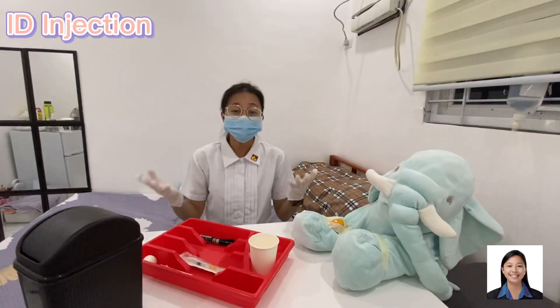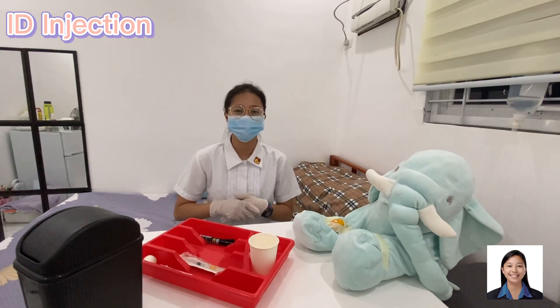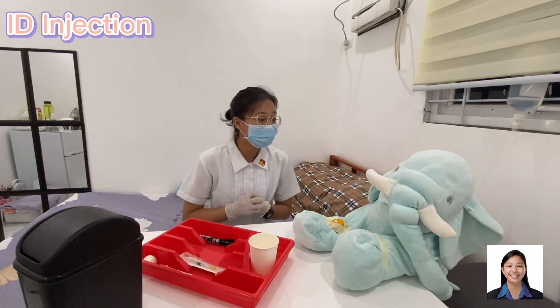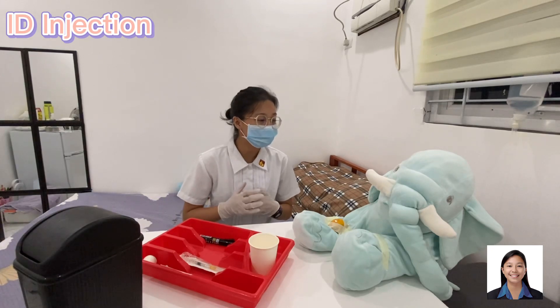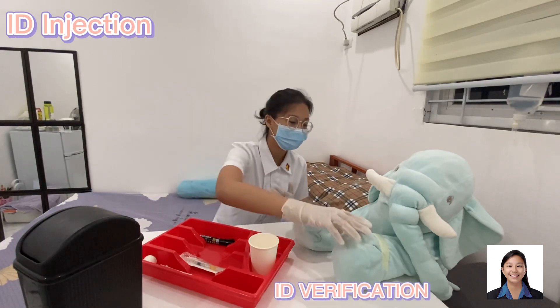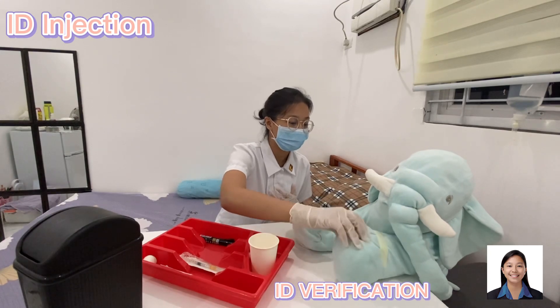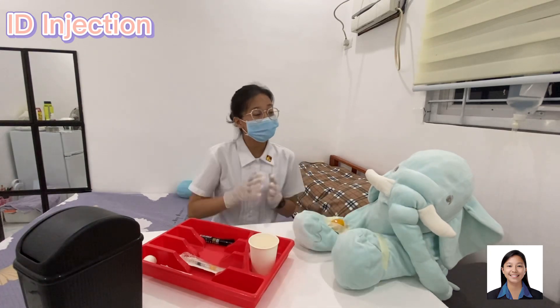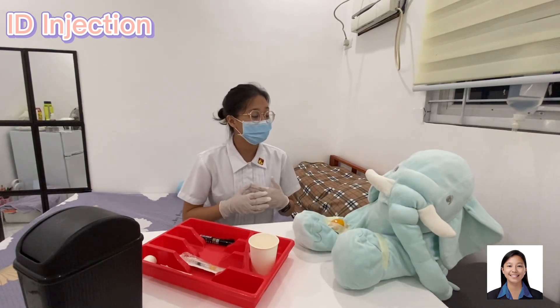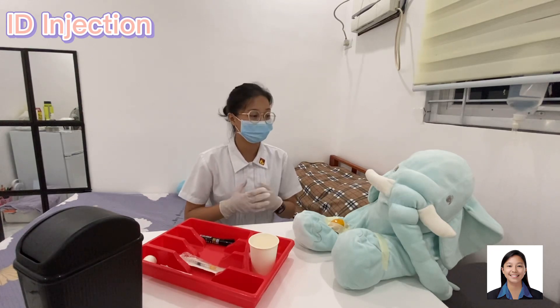First, we will do the intradermal injection skin test. Good evening, sir. I'm Shane Carlong, your nurse for today. May I check your wrist? I'm going to perform a skin test to make sure that you don't have an allergy to the drug.